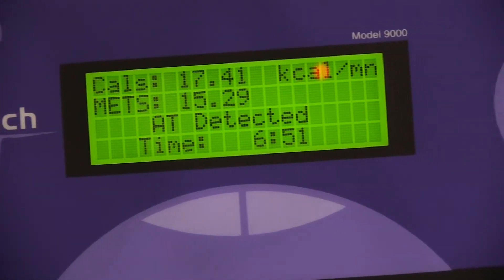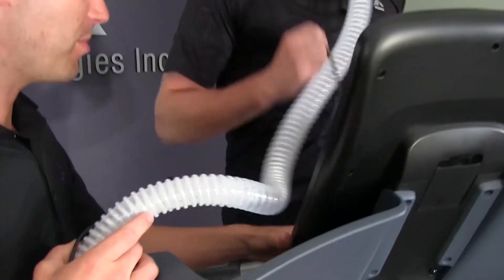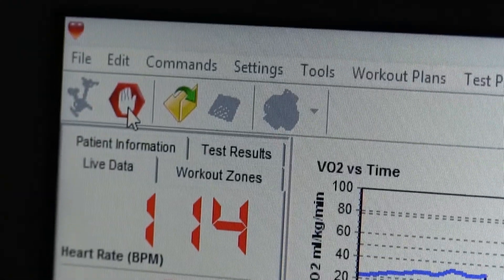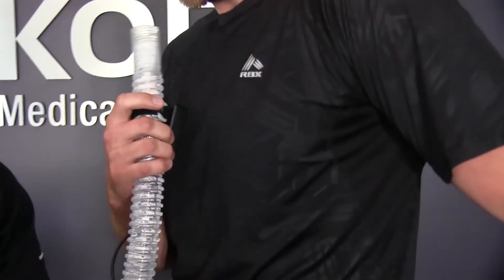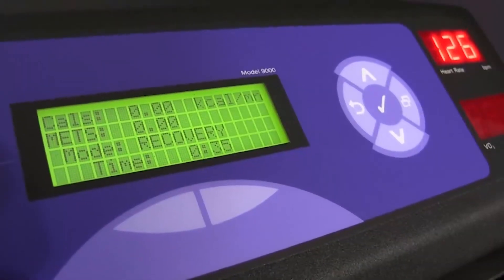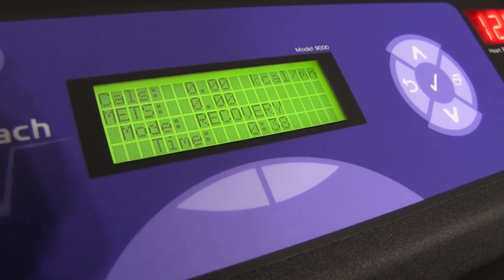Once the client reaches their anaerobic threshold, 'AT detected' will appear on the LCD screen. To complete a sub-max test, continue the protocol at least 1 to 2 minutes until the client is ready to end the test. At that point, hit Stop on the bike or treadmill and click the red stop sign in the top left corner of the screen. This will end the test and begin the recovery process, which lasts about 2 minutes. You will receive a prompt asking if you would like to begin the recovery from now or peak. By selecting peak, you can start a 2-minute countdown from the moment the client reached their peak measurement. Now that the test is complete, you can print the results and review them with your client.